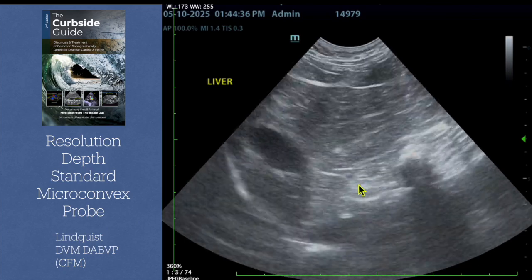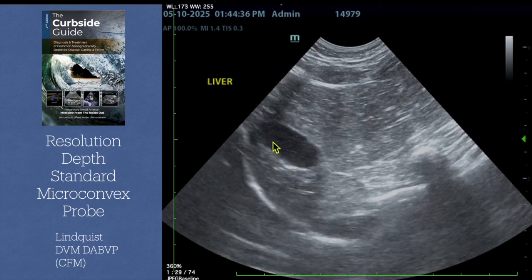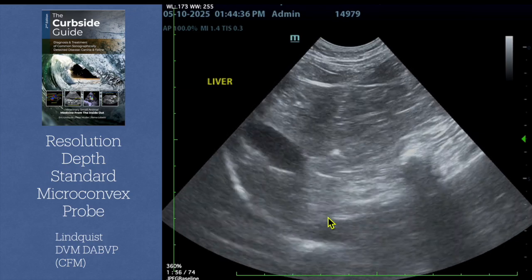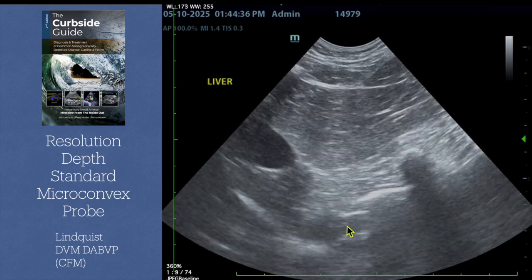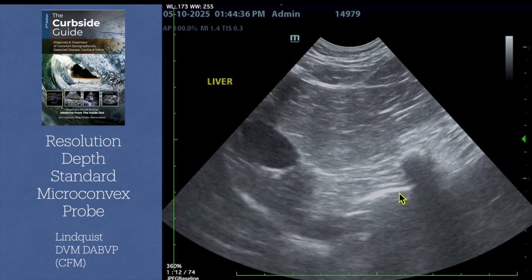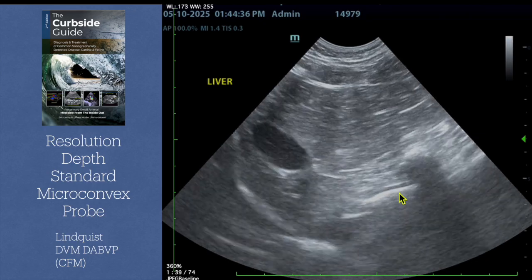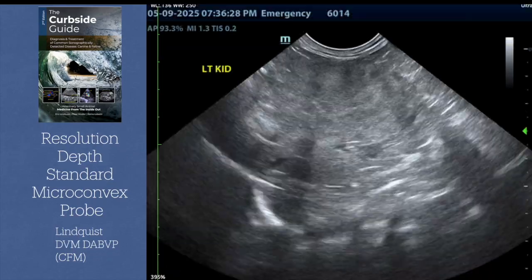So you're going subxiphoid, which should be fairly clean unless there's something in the stomach. You're going to go intercostal, which we're going to see some images here. That means the sound beam has to penetrate through the body wall, get in between the ribs, and get into the liver to make sure that you're catching all of the lesions that may be in the liver, right? So I think testing machines and resolution depth and 9 through 14 is really solid. And then you just make a note, okay, resolution depth 6 centimeters solid. Okay, great. So then we go to the next one, right?